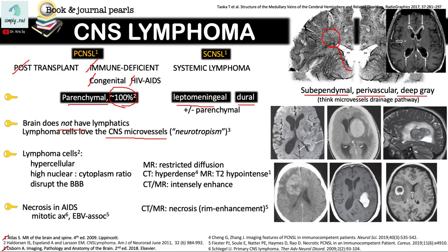This example shows subependymal spread. The next key concept is that lymphoma cells are hypercellular. If you have hypercellularity, you have restricted diffusion on MRI.